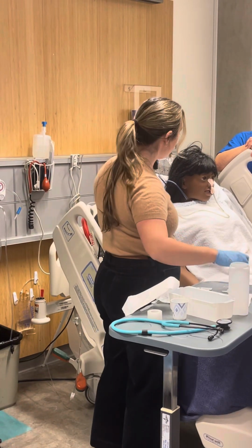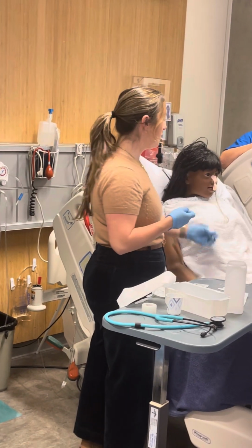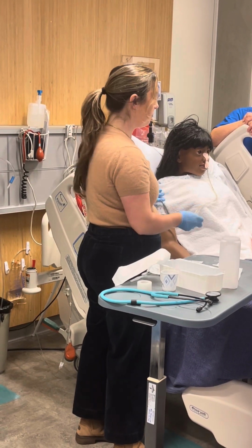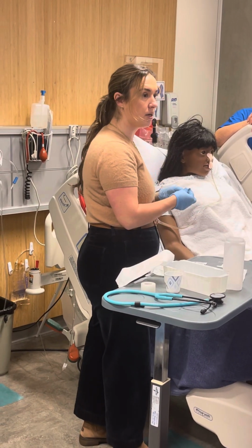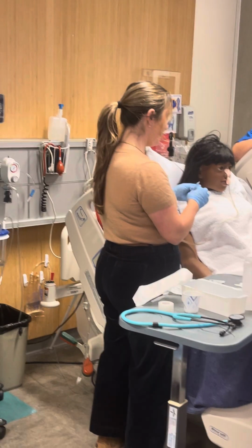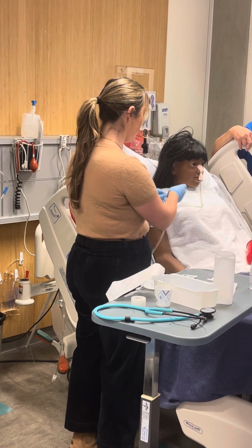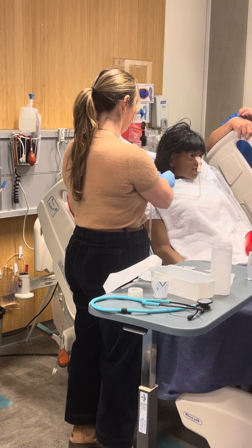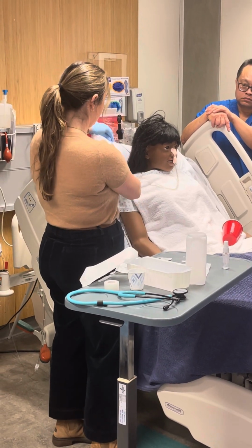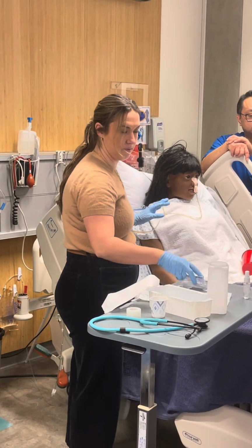Another thing you're gonna do is secure it to their gown so that it doesn't hang down like this. You want to make sure this vent stays above the stomach, because if it goes below, it'll start pouring out gastric content. So you're gonna use this to create a little securement here, and then tape it to their gown, or safety pin it to their gown, like that. Sometimes if I don't have anything, I'll use a piece of tape as a flag, and then I'll use a pin.